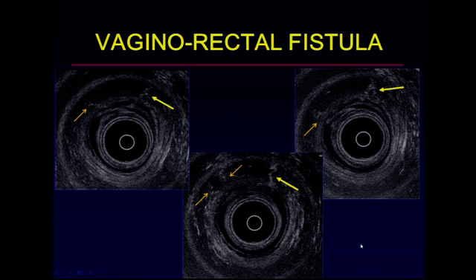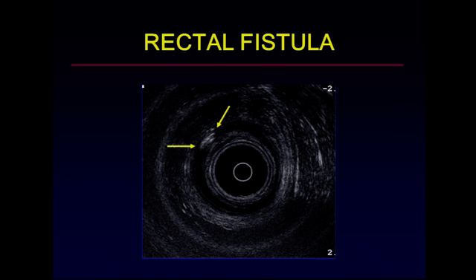that the fistulous tracts are resected, and that this isn't just a simple fistula through the external sphincter at the 1 o'clock position, but there's a second and possibly a third smaller tract at about the 10 o'clock position. And this is very important because if one had missed these tracts over here at the 10 o'clock position, as I mentioned, this is a common cause for recurrence of symptoms and even recurrent abscess formation.